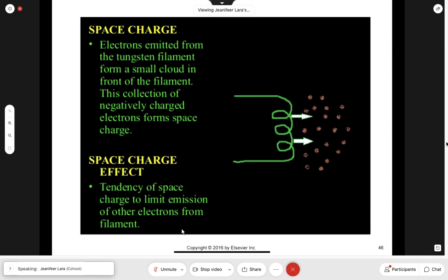Stephanie, what is a filament made up of? It's made of tungsten with a splash of thorium. I love splash. Good. All right. Perfect. Tracy, what's the focusing cup made of? Nickel. Perfect. So electricity is coming into the filament. What's happening to the filament again? It's being boiled off through thermionic emission. What's happening to the filament when the electricity is energizing it? The filament released the electron.